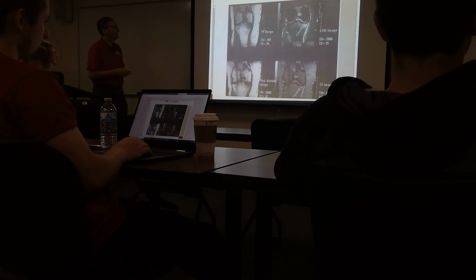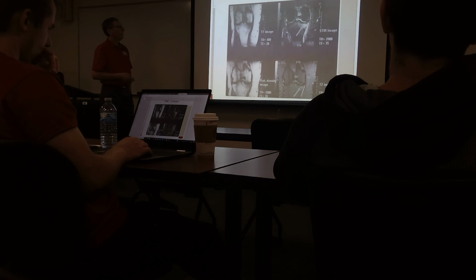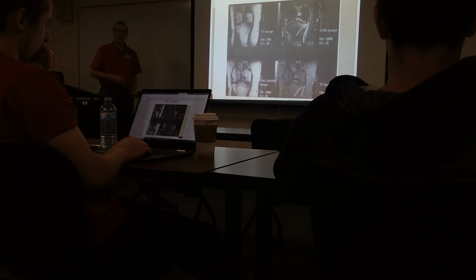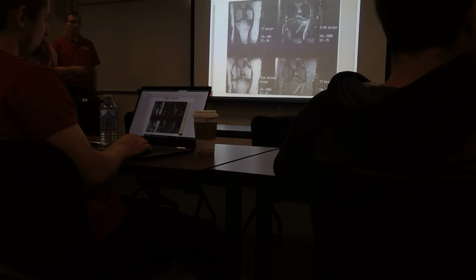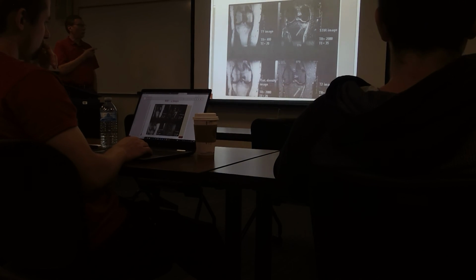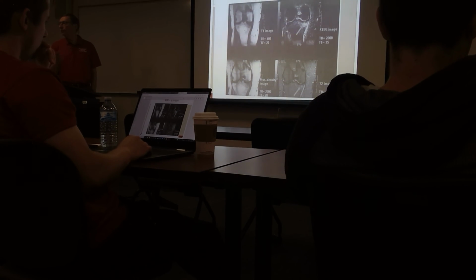Okay. If we look at a T1, a T2, a STIR, a T1, a proton density, a T2, and a STIR, where do you see the defect the best? I'll give you a hint, the defect is on the tibia. Yeah. Person has a compression fracture of the tibial plateau. And all those properties we talked about, we rely on the physician and the technician to determine the best image. They can do one MRI scan, and they can do all these calculations at the beginning, so they don't have to do 4 repeats. So it's really pretty cool.